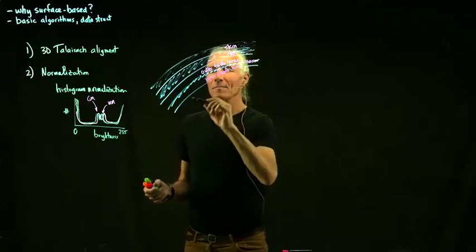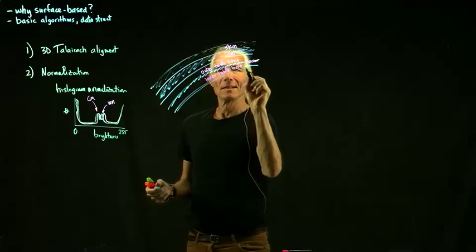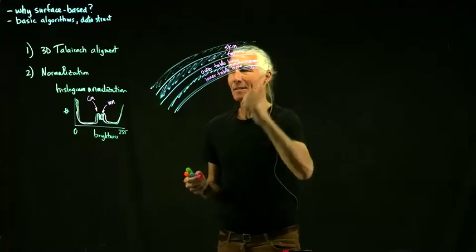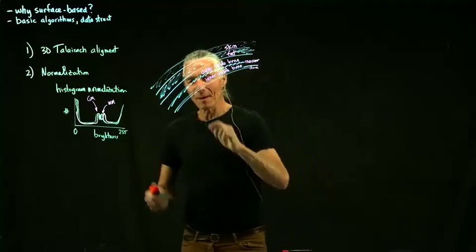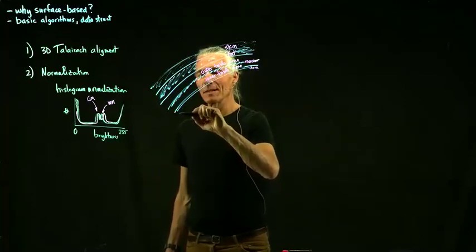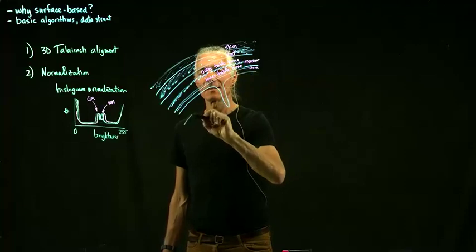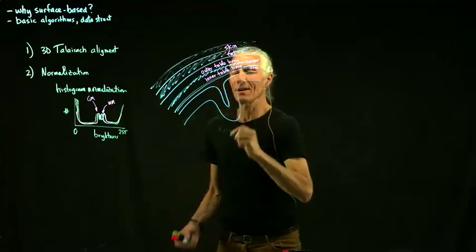And then sometimes you can see the dura, which is a thin, leathery layer. So here's the dura that shows up sometimes. And then there's some more black, which is the cerebrospinal fluid. And then you have the actual cortex in there, like this. And so there's all that junk. How do we strip all that junk off?